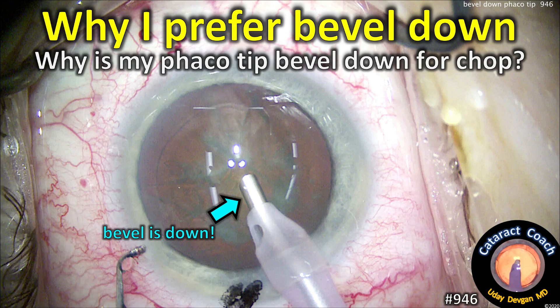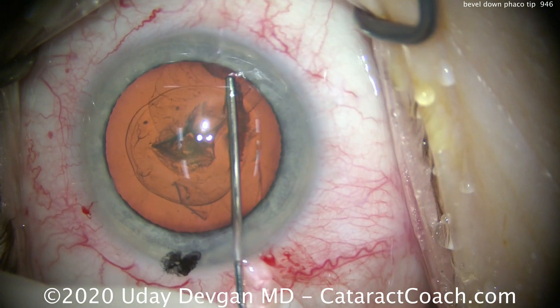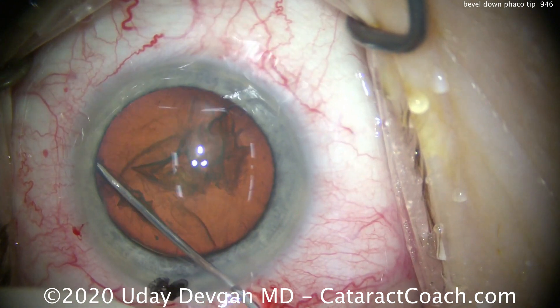CataractCoach.com. Why I prefer bevel down. So why is my phaco tip bevel down for phaco chop? I get asked this question all the time, and let me explain it to you.